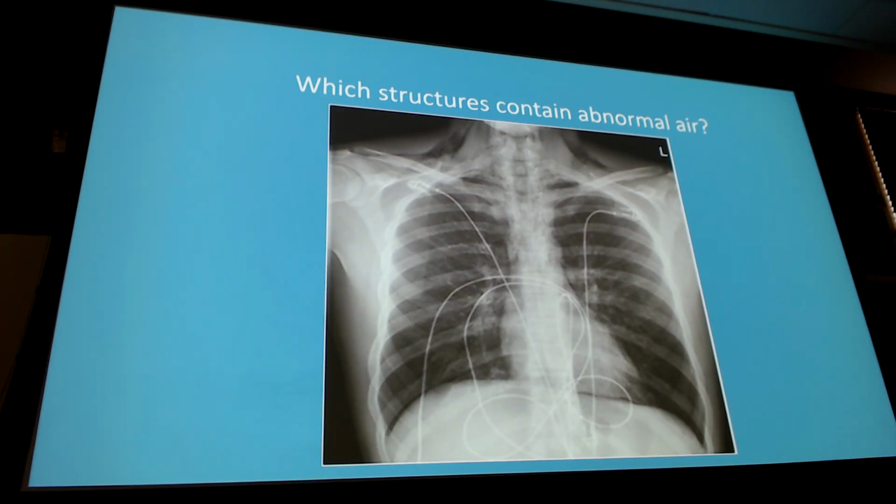Does the pathophys of that, the process of air, does that kind of register? Lots of clues to where even if you don't see the air in the great vessel area, you go, well, where is the cutoff? Because I was getting the question like, is it rib 5? Is it rib 4? It's different for every patient, right? Depending on how their anatomy sits, it's a little bit different for each patient, which is why we have these other clues like the diaphragm sign and the subcutaneous emphysema to help us make that pneumomediastinum. You're like, I can make that diagnosis.